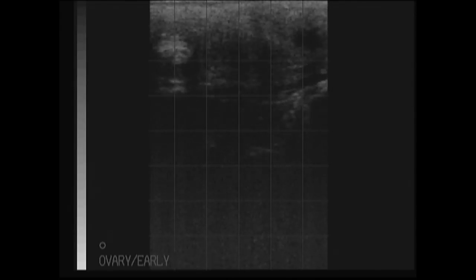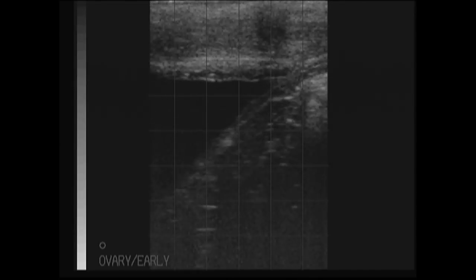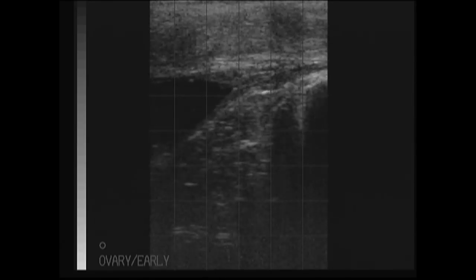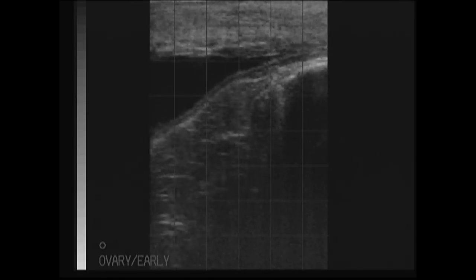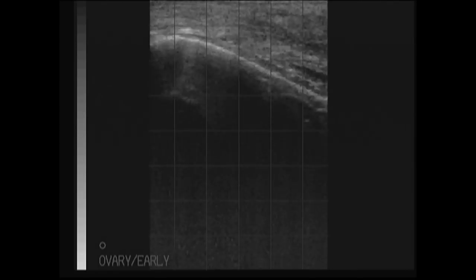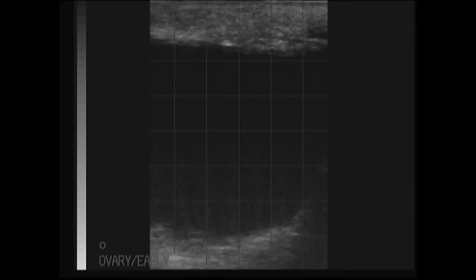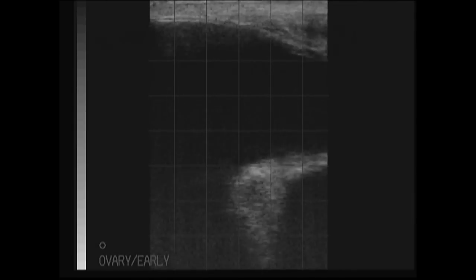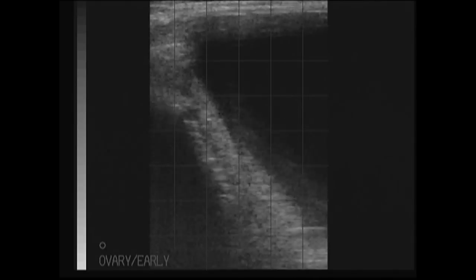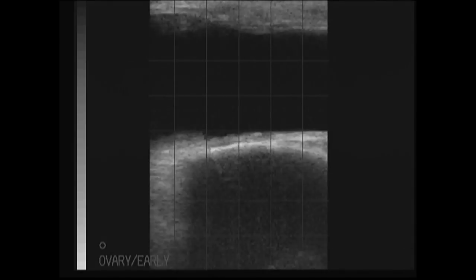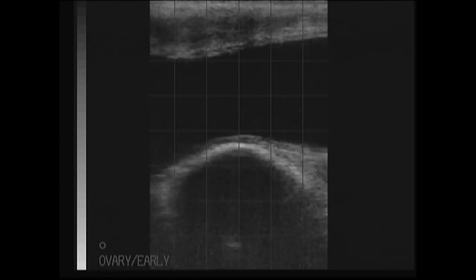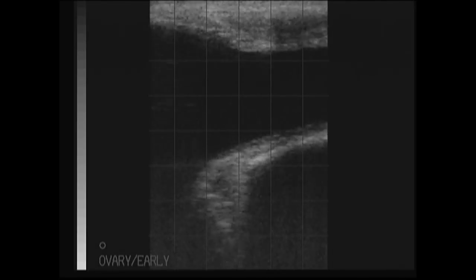I will now describe in greater detail the specific structures which can be visualized on this ultrasound video clip of the pregnant cow. The ultrasound probe has been inserted via the rectum into the cow and we will perform a methodical ultrasound examination of the entire reproductive tract. This includes the cervix, the uterus and both ovaries.